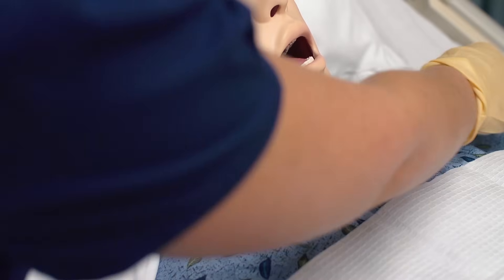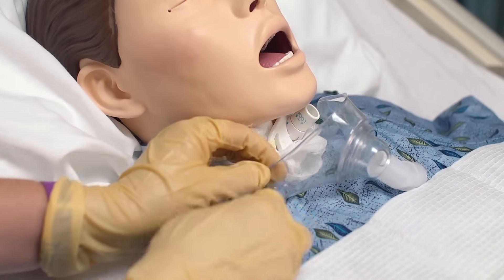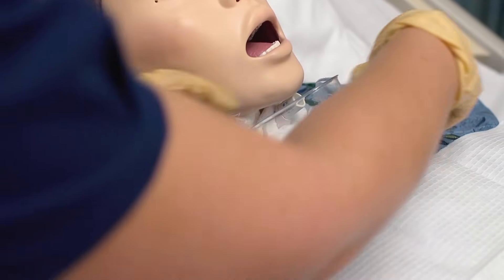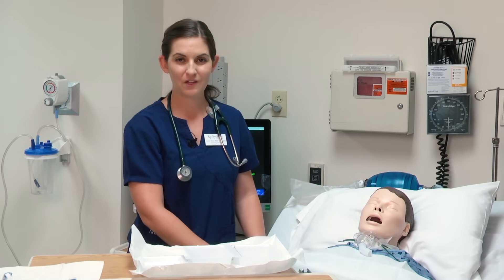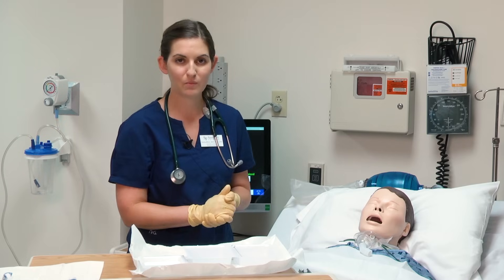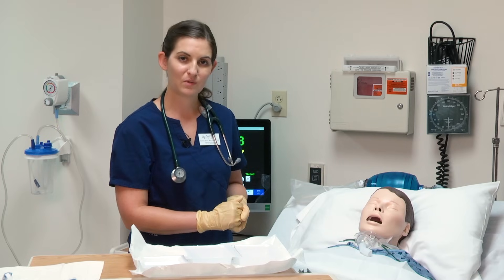I want to replace my mist collar. That concludes the tracheostomy video covering suctioning as well as tracheostomy care. I still need to dispose of my gloves and supplies. Before leaving my patient, I need to make sure the side rail is up, they have their call light, and they are in a comfortable position.